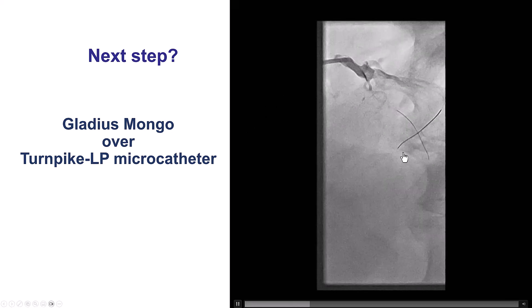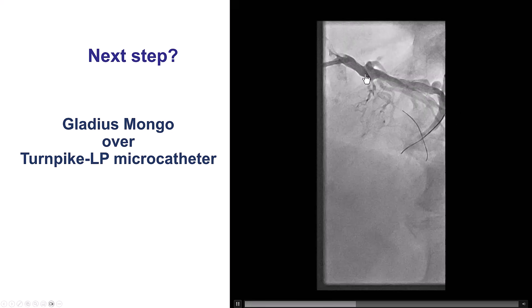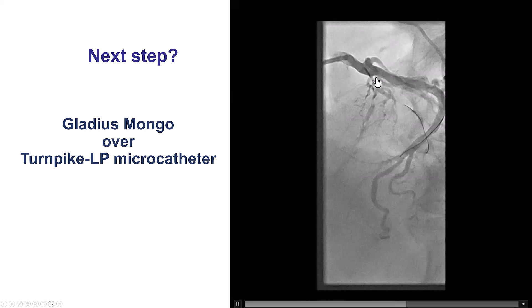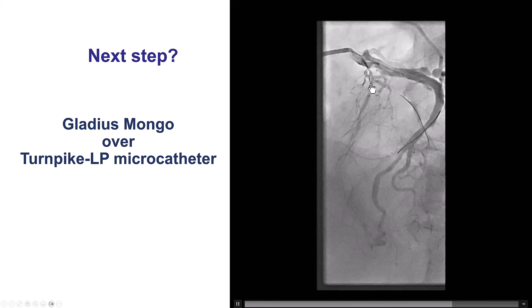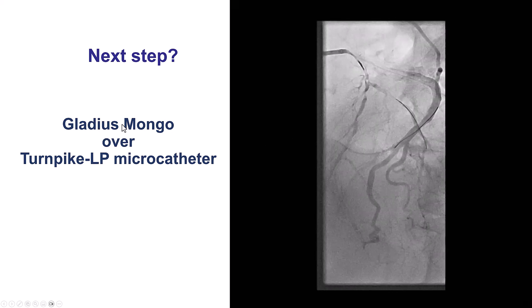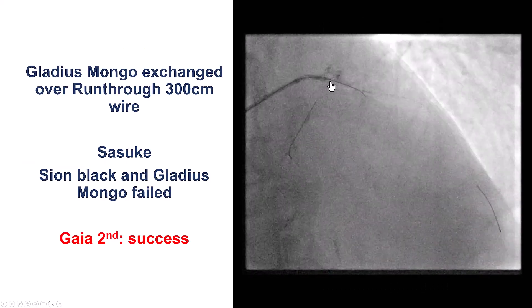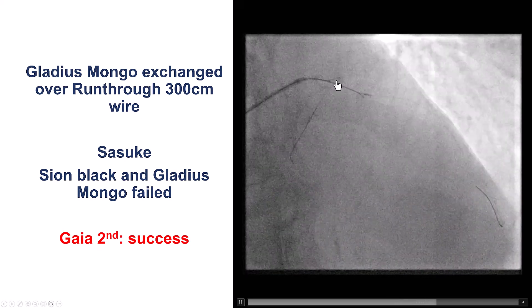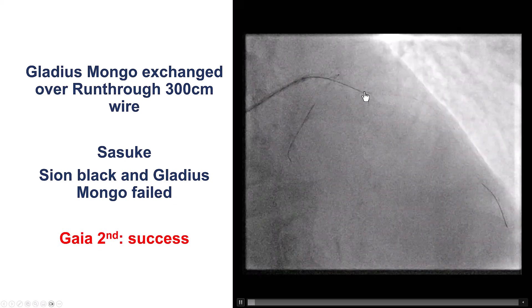This is the wire anchoring our guide catheter into the circumflex, and we had a microcatheter — a Turnpike LP. We tried several wires: workhorse wires and soft polymer-jacketed wires, but we could not cross through that occlusion of the LAD. We then tried the Gladius Mongo, but once again we were unsuccessful. We eventually exchanged for a Sasuke dual-lumen microcatheter, through which we tried again the workhorse and polymer-jacketed guidewires without success.